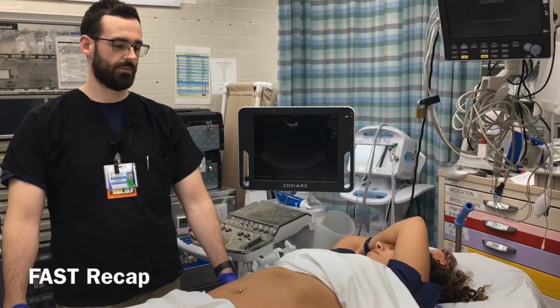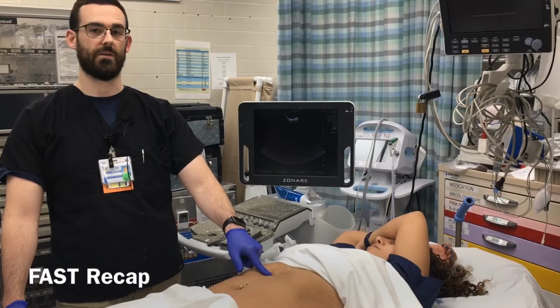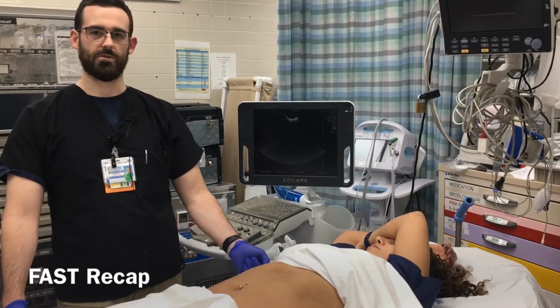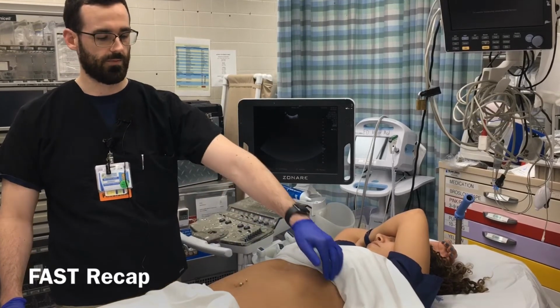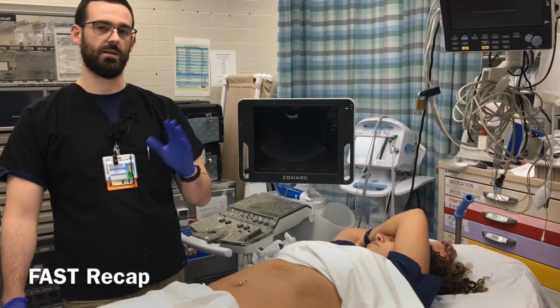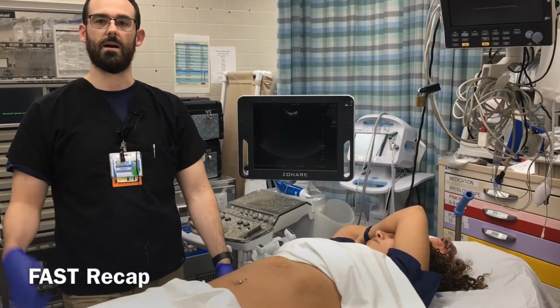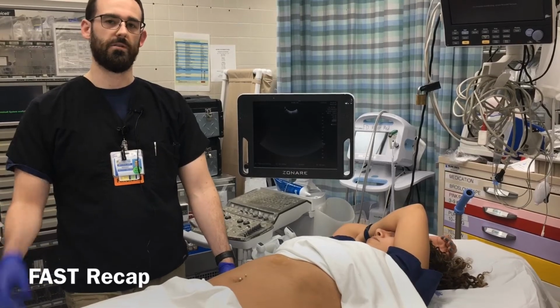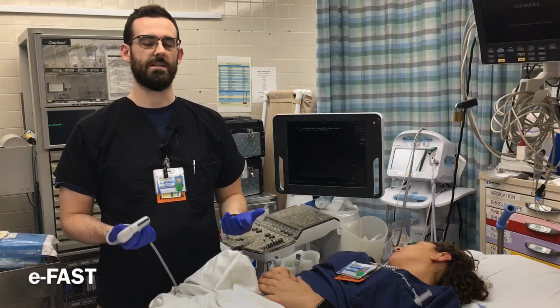As a quick recap, we have the subxiphoid area looking for free fluid around the right ventricle. You have the right upper quadrant looking for free fluid between the liver and the kidney. You have the left upper quadrant looking for free fluid between the spleen and the kidney, or between the spleen and the diaphragm. And then you also have the pelvis looking for free fluid behind the bladder or in front of the bladder. So the next thing we're going to talk about is the EFAST, or extended FAST.